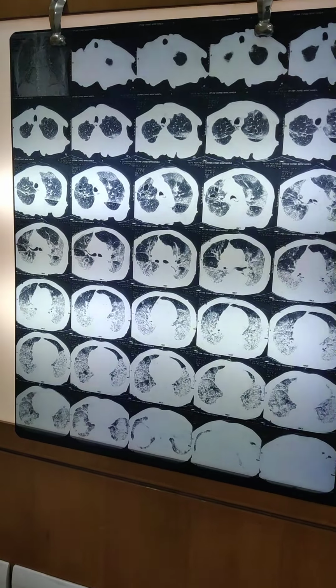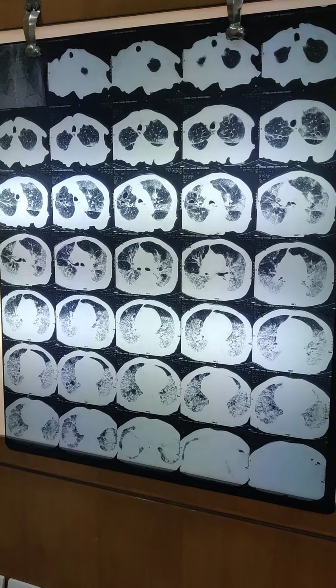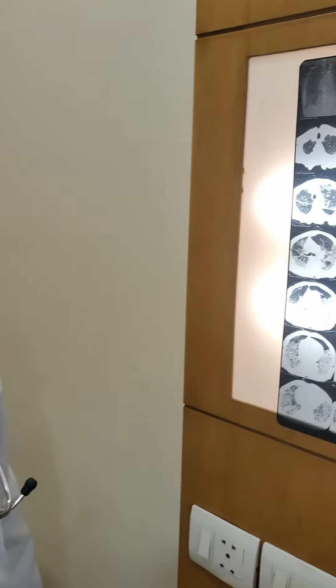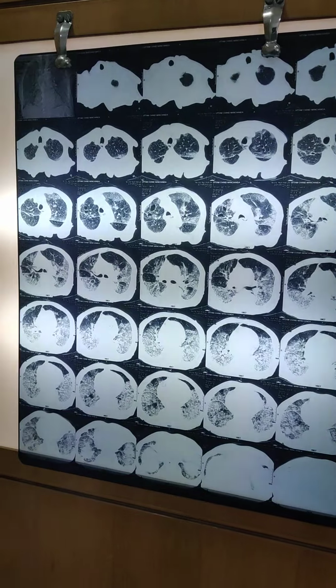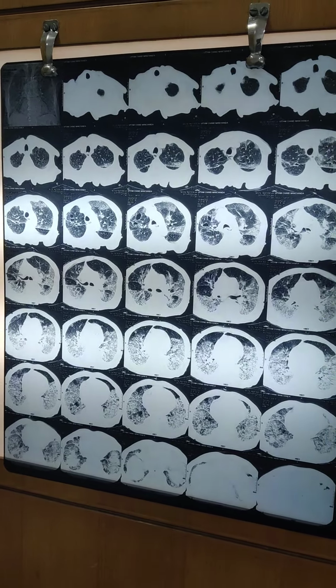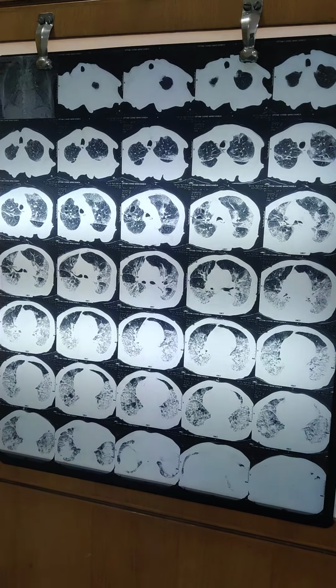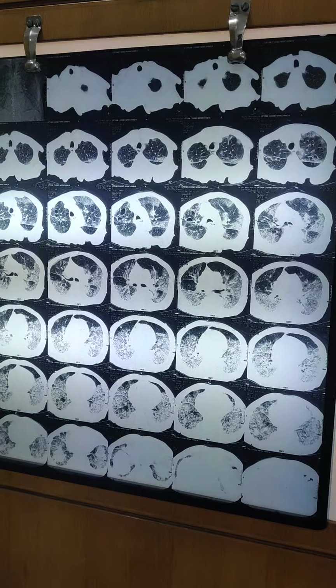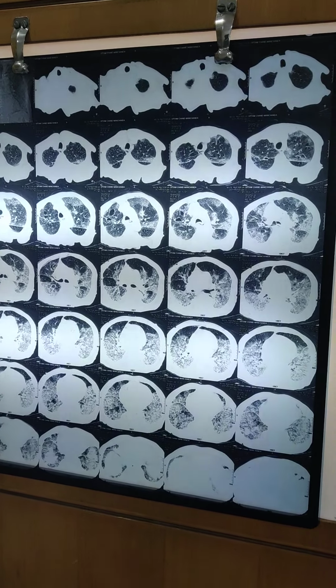These are the interesting, hands-on series which I will be teaching the students. We have Naren here. So Naren, this is an 82-year-old man, a frail man, presented with fever, cough, dyspnea. His oxygen requirement is very high. He's RT-PCR positive. His COVID with respiratory failure.